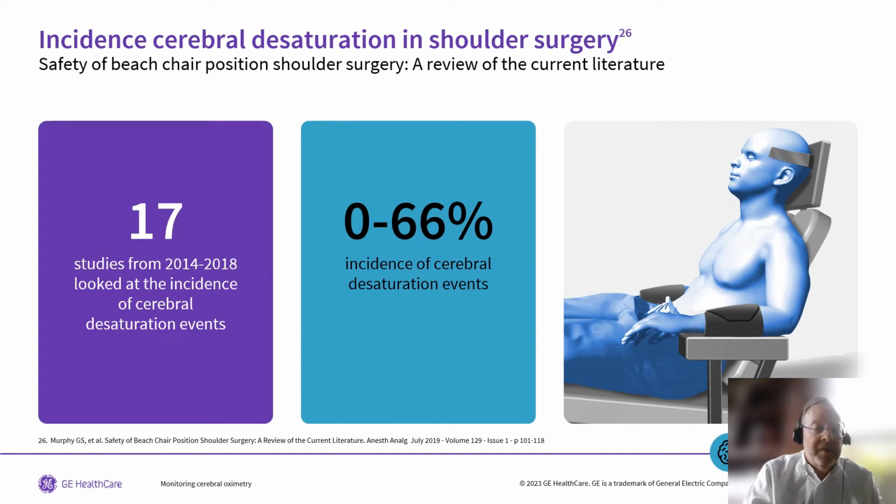There have been a lot of studies looking at the incidence of cerebral desaturation events. In this large review study, there were 17 studies that showed an incidence between 0 and 66% incidence of cerebral desaturation events. That's quite a wide variation, but this incidence is particularly striking when we're looking at studies comparing beach chair positioning to patients undergoing surgery in the lateral decubitus position.